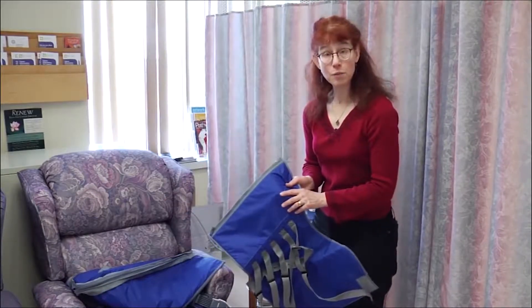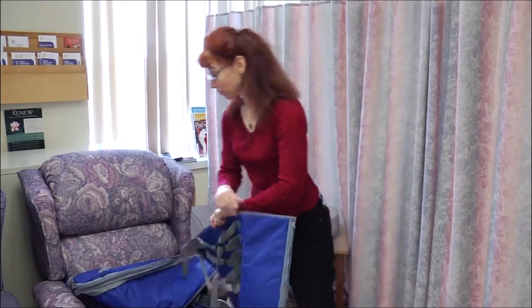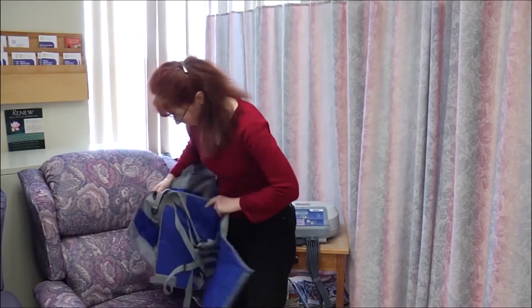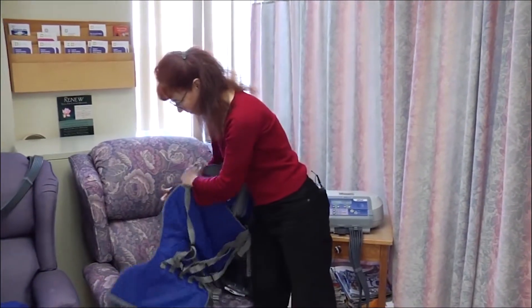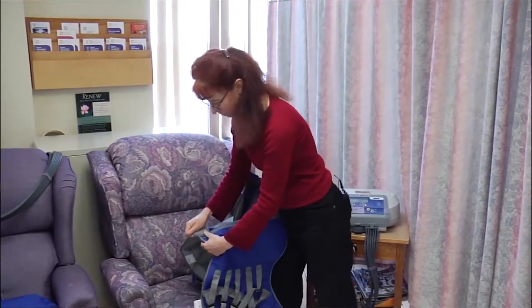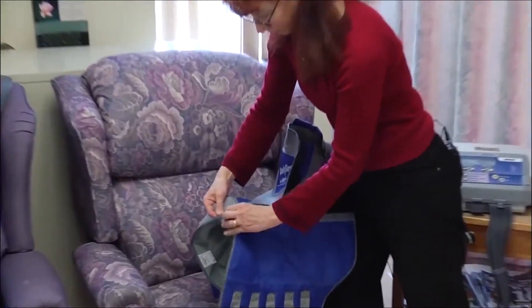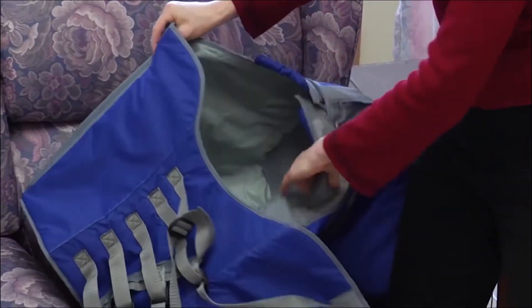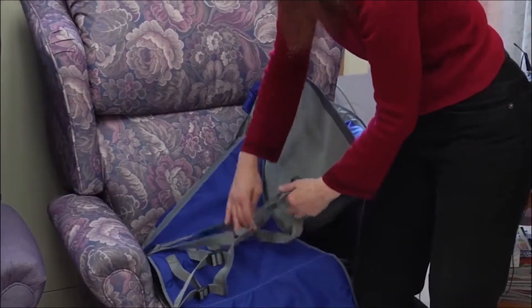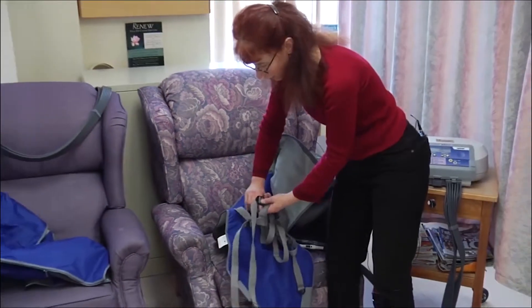For this patient, we're going to be treating her left side, so this is a left-sided adapter. I'll go ahead and zip the adapter in so that it forms a sort of jacket. It's also useful to extend the straps fully, because it makes it easier to put the jacket on.